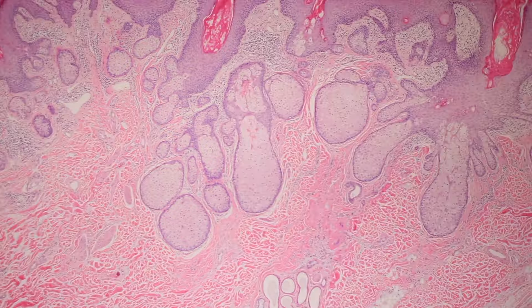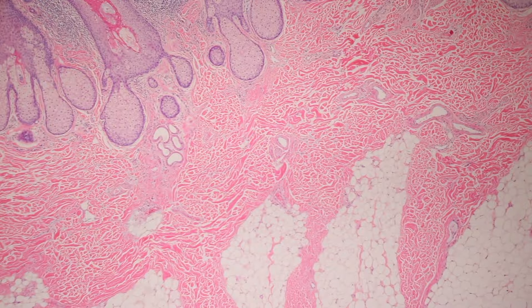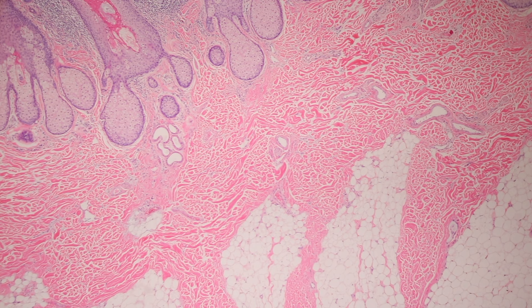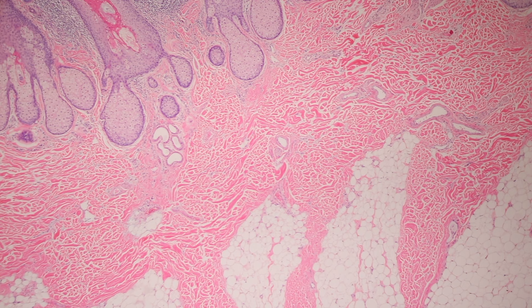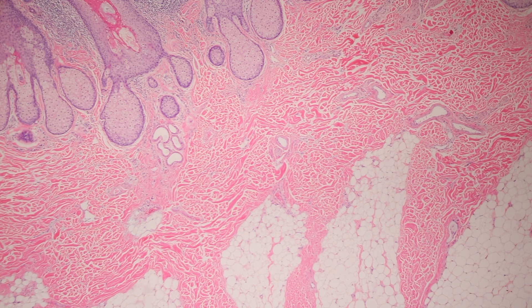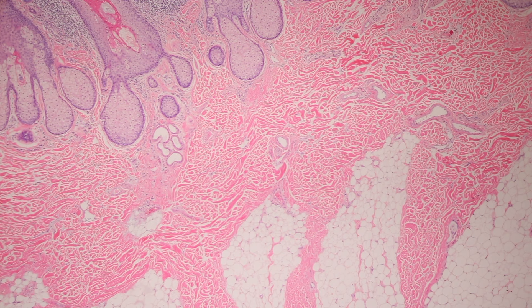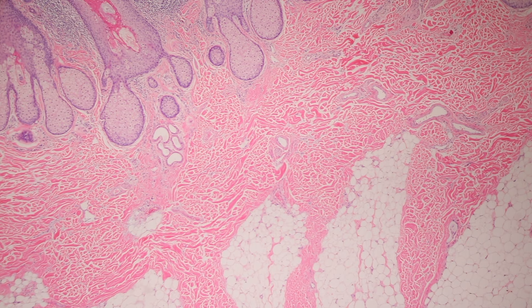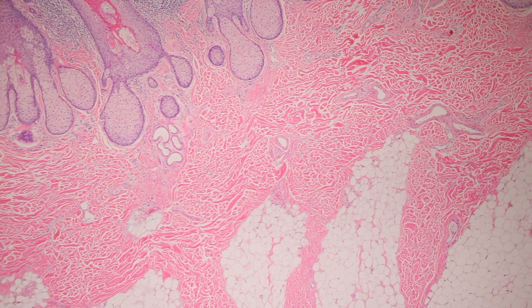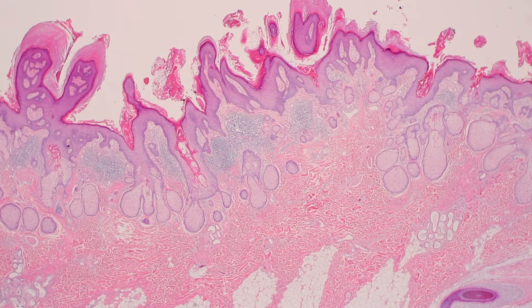You may be wondering what on earth is this lesion — it has sebaceous glands, apocrine glands, funny epidermal changes, and the hair is gone. These are probably hamartomatous processes. Anytime you see normal structures like apocrine glands present in a site where they don't belong, you have to think about whether this is a hamartoma or ectopic process. These are all normal skin structures — they're just mingled together in an abnormal way at this site. This unusual organization of normal benign skin structures is what nevus sebaceous represents etiologically.